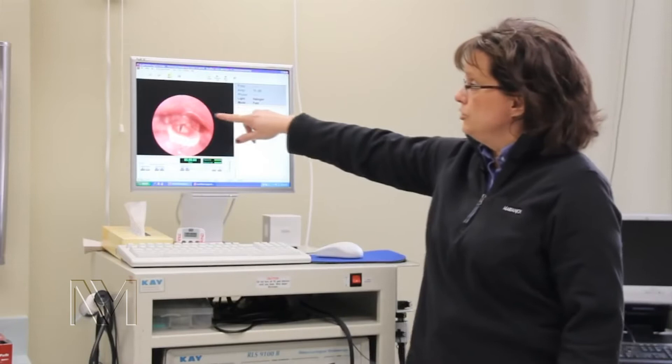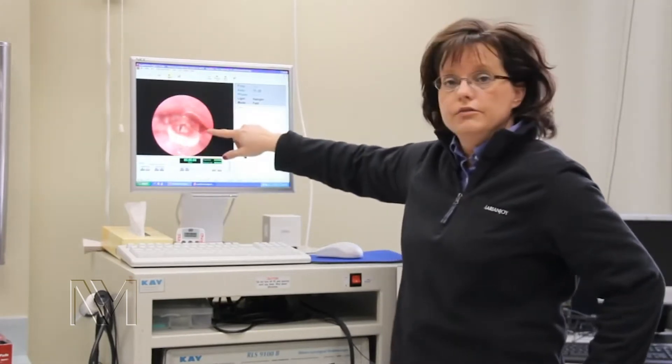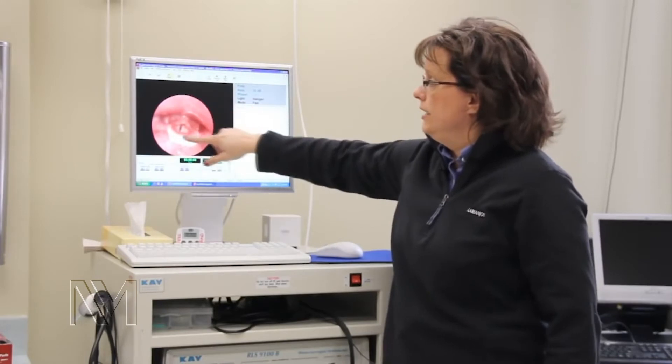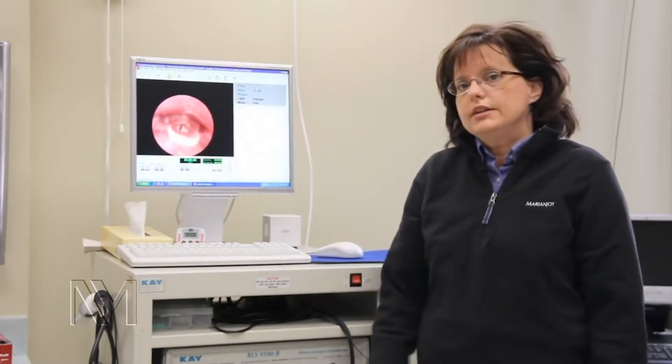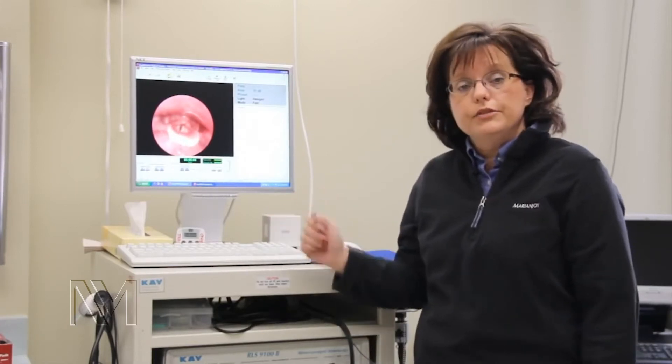One of the advantages of the FEES procedure is it actually allows you to see the anatomy of the voice box. We can look at the vocal cords, the epiglottis, and the base of the tongue while you're swallowing. It also allows us to assess secretion levels and evaluate voice and swallowing within a single exam. The exam is also recorded so we can play it later for the patient to view as well.